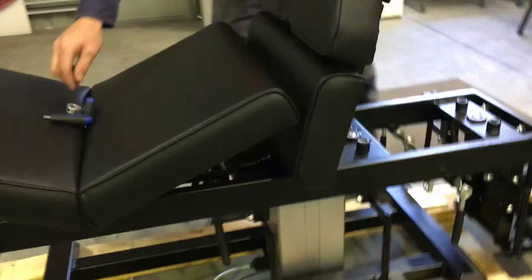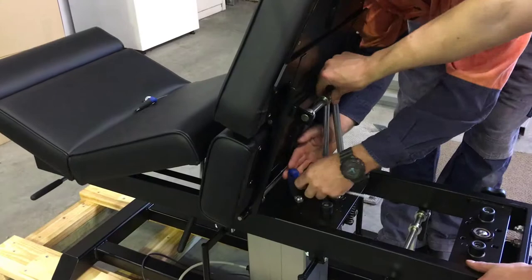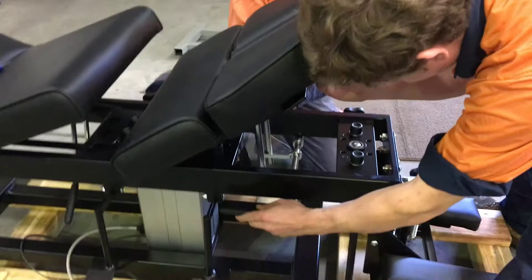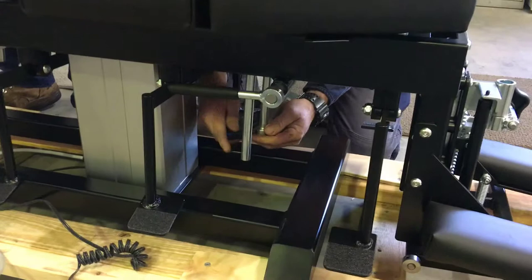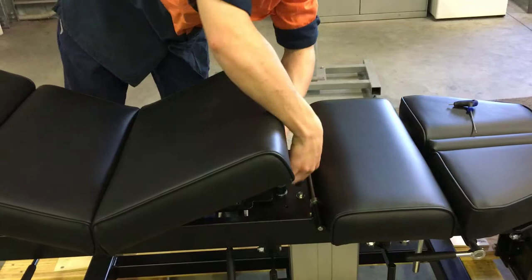From here it's just a matter of reversing the process to tighten the table. Make sure the table is at the correct angle, with the top and base aligned and parallel to each other. Then fit the locking nut at the end. We're not putting excessive force into the nuts so you don't strip the threads — you'll have your spring washers and washers to stop it from vibrating loose.